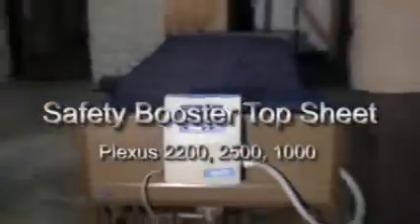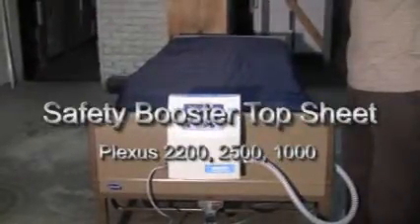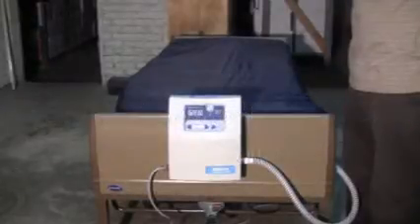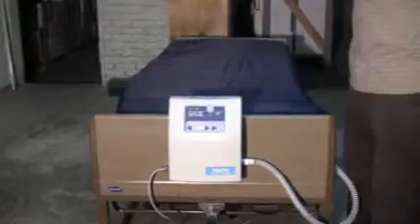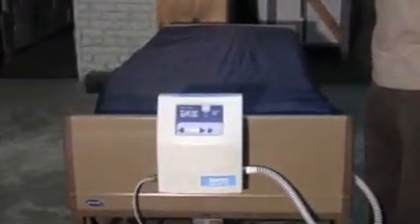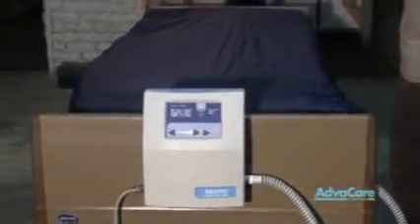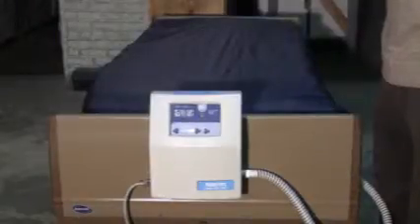Your Plexus 2200 low air loss mattress replacement, your Plexus 2500 low air loss alternating pressure mattress replacement, and your Plexus 1000 alternating pressure mattress replacement may have an added safety bolster top sheet for patient safety and patient positioning.